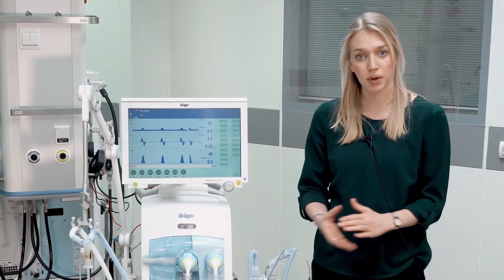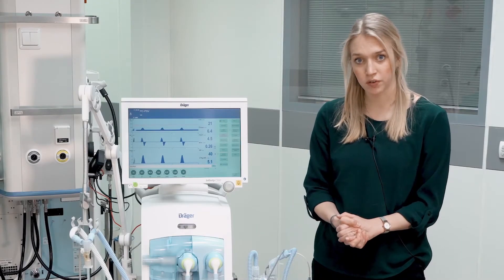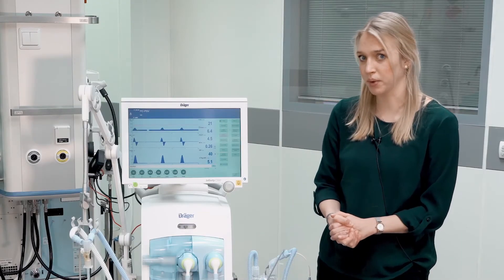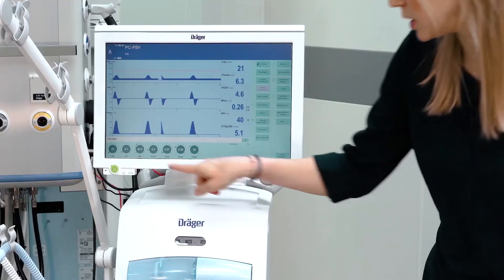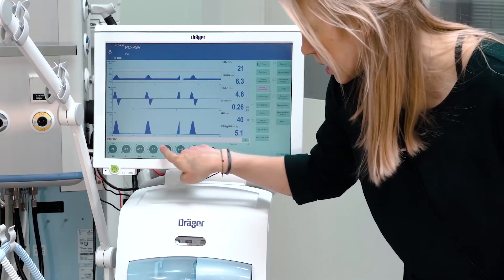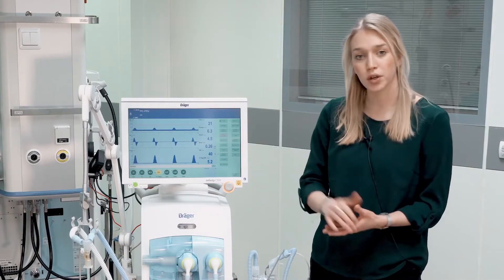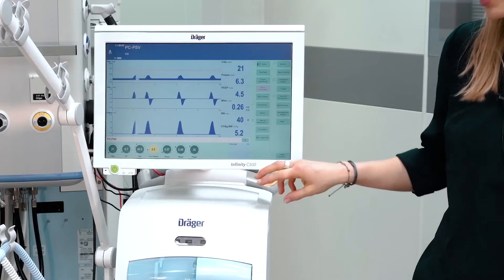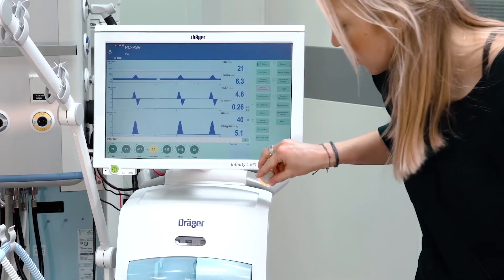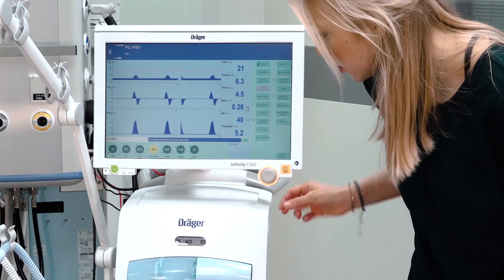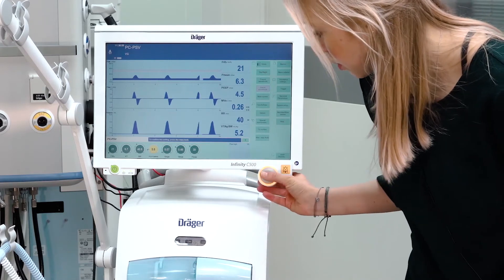If you want to apply changes to your ventilation parameters, please select the respective parameter, turn it to the desired value and confirm by pressing the rotary knob.